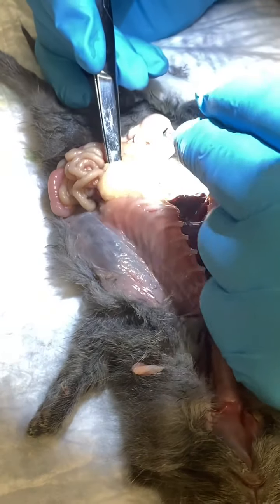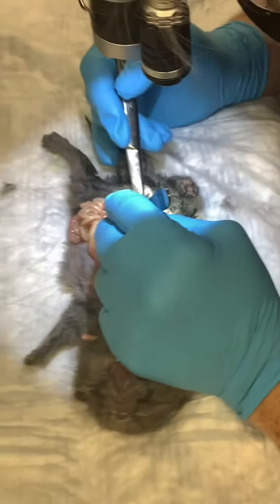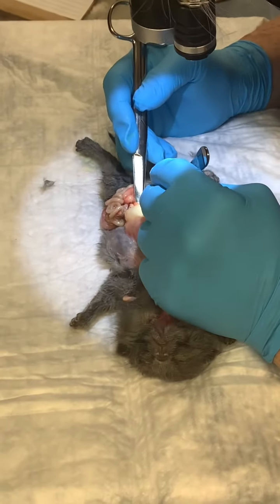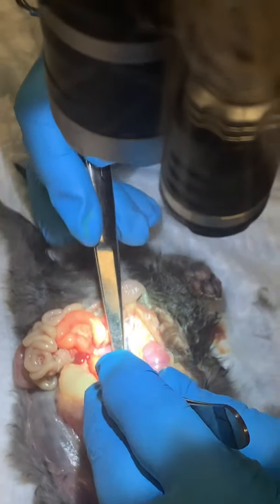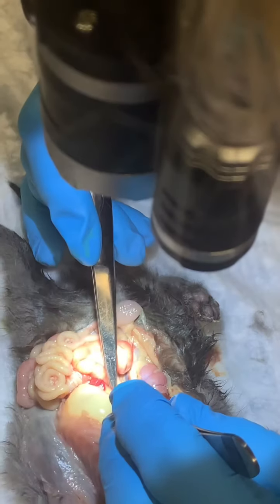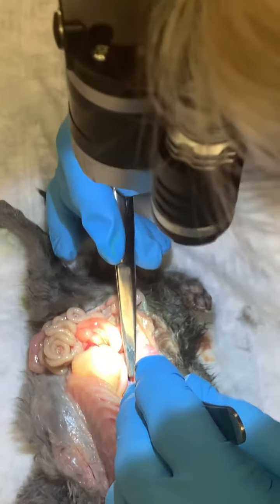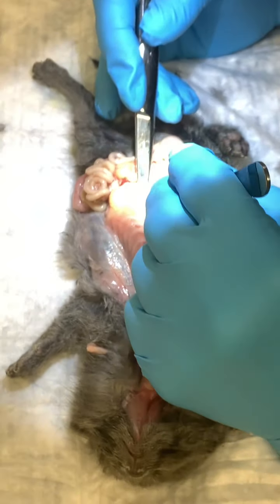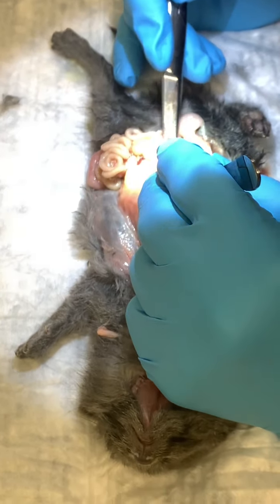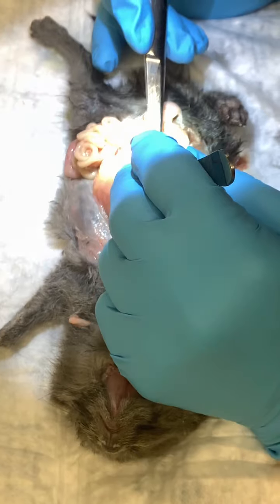Now the other one, there it is. Well, that may be an abnormal shaped one because they lay kind of opposite of each other. One is like Mr. Peanut and one's like a lounge chair. I don't get that though on these. I don't see a Mr. Peanut.